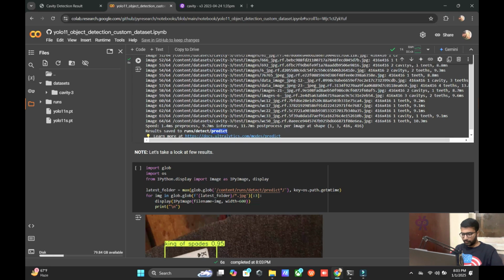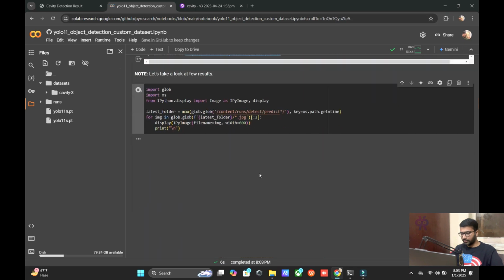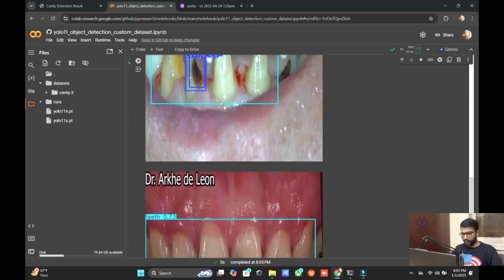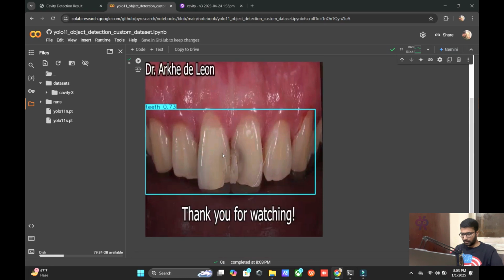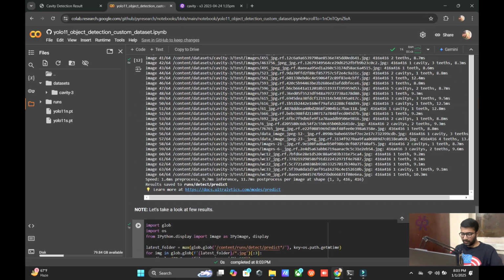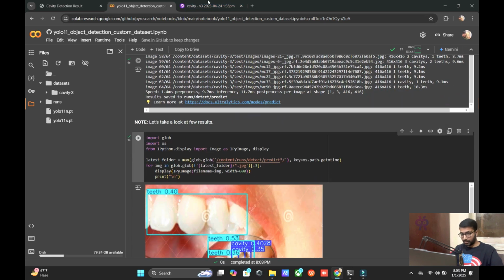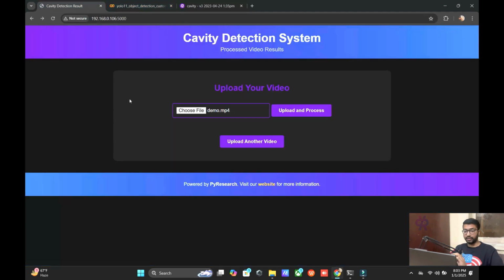Okay, the total number of images is 64, and we are predicting only 3 images, showing you here cavity and teeth. Here, teeth. Okay, it's complicated medical AI, but in front of you we are exploring the technical terms. So now, this type means the interface type.